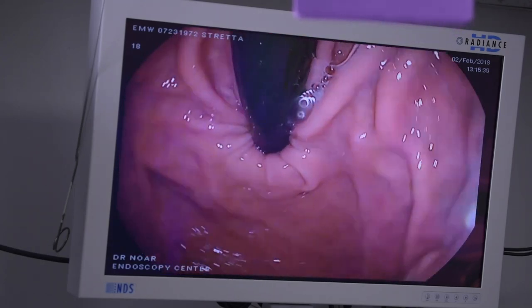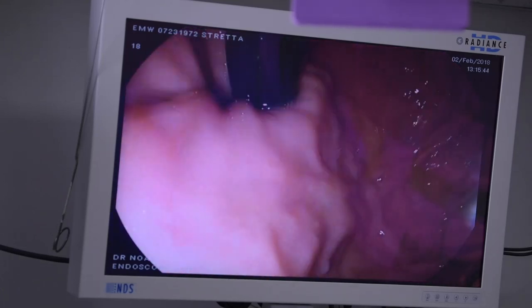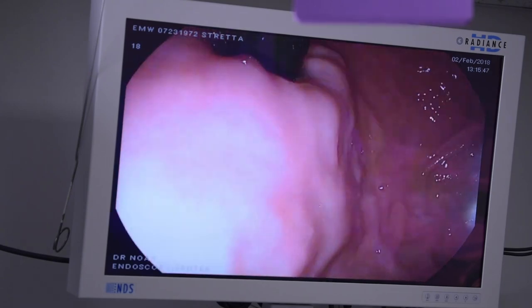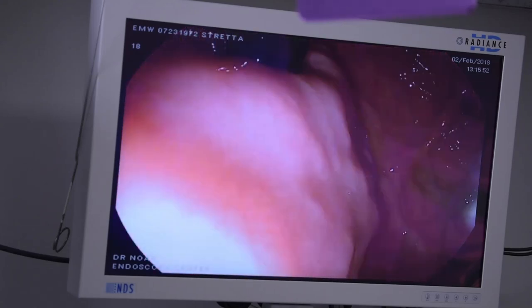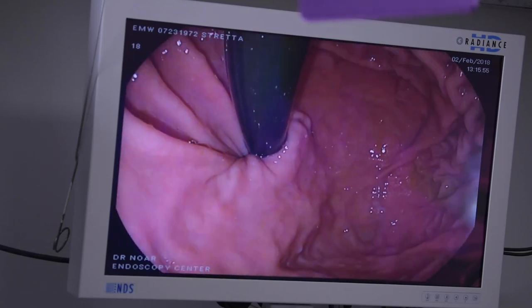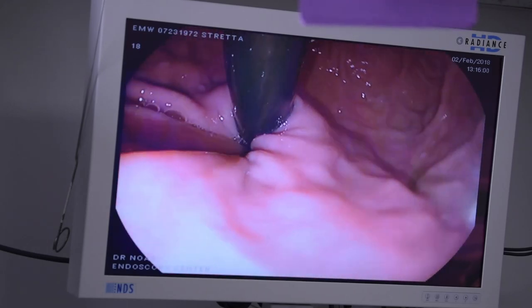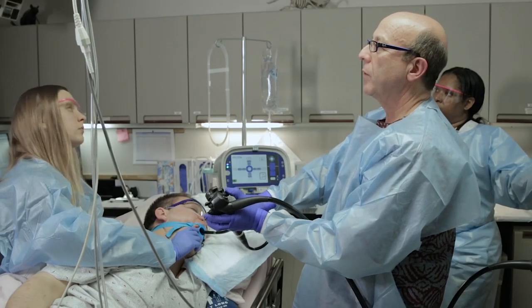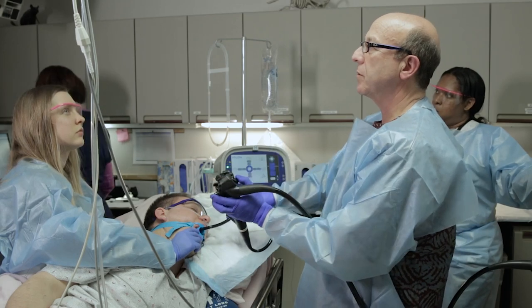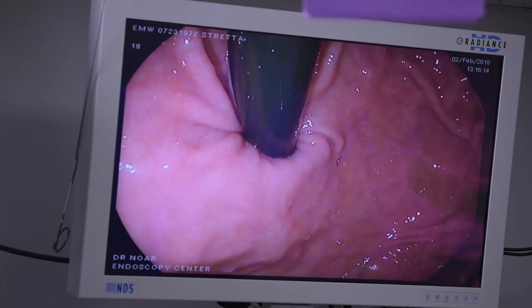Coming back to look at the top of the stomach — the bottom of the sphincter — we can see he has a small hiatal hernia. As I move the scope in and out, you can see the tissue rolling up into the esophagus and then back out. This indicates that the ligaments supposed to hold the esophagus firmly under the diaphragm are loose. He has about a one to two centimeter hiatal hernia, which is not going to be a problem when we do his procedure. We'll document this area and you'll be able to see the effect once we're done.